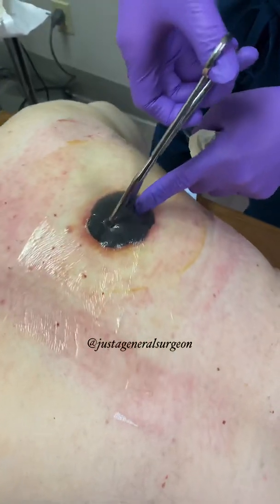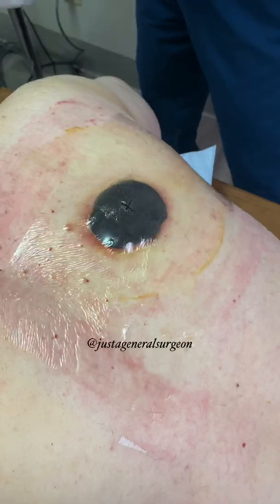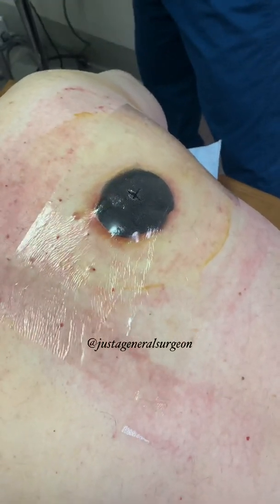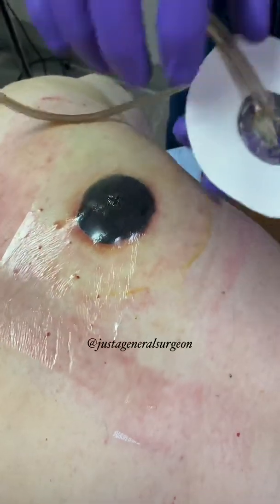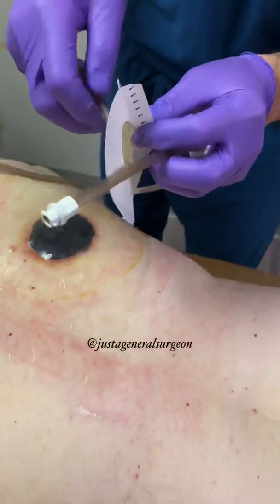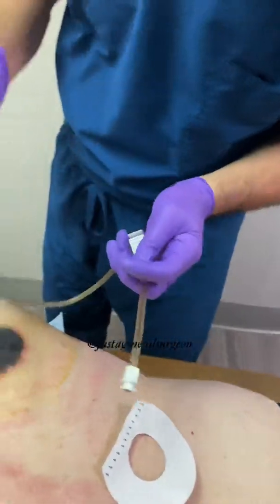Then you cut a little opening over the sponge and connect it to the suction area. This is the suction device portion here. Remove this cap and bring it down like that.